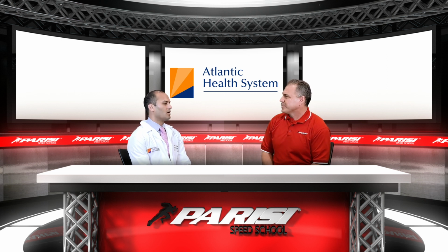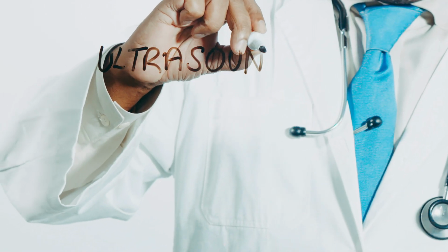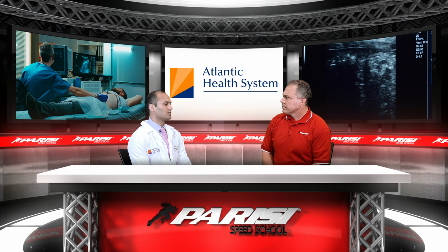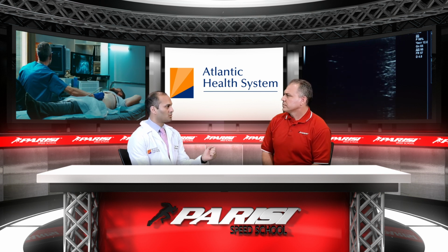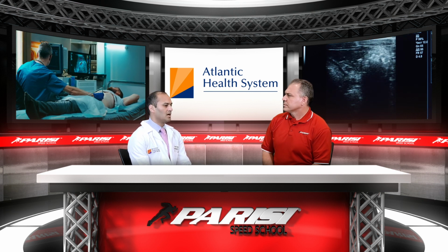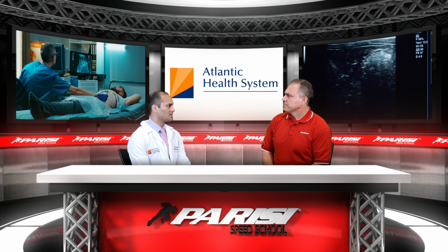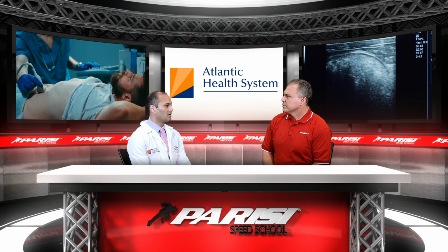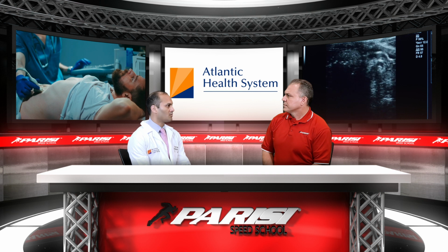Yeah. So other tests we could use, ultrasound. It's very easily available. It uses no ionizing radiation again, and we basically just put the probe on the patient. It sends out sound waves, and we get a picture back. And that picture can show us things like muscle, tendons, ligaments, joint fluid, and we can get a lot of information. And another benefit of ultrasound is it's being used at the same time while we're with the patient.